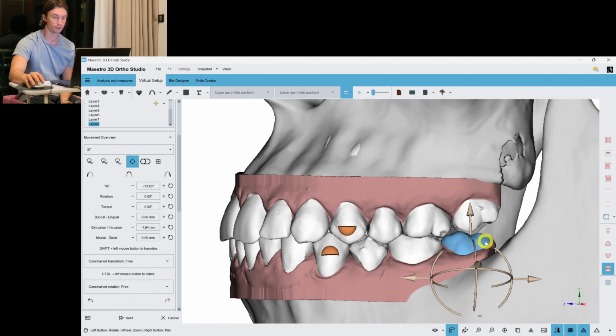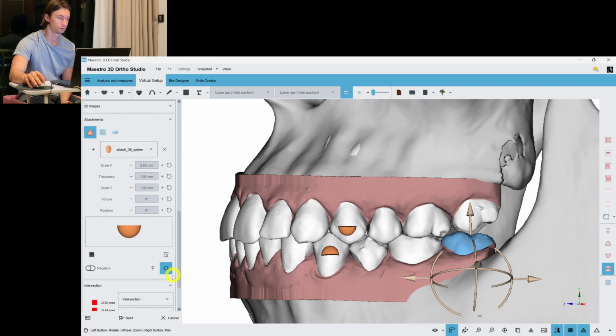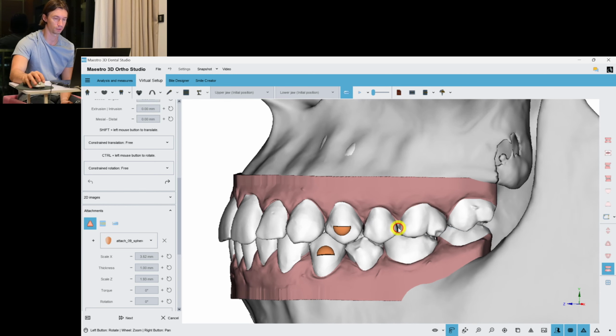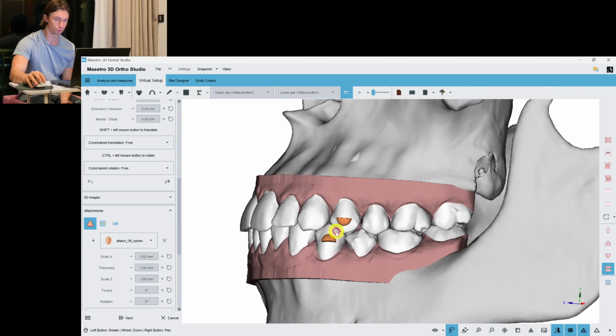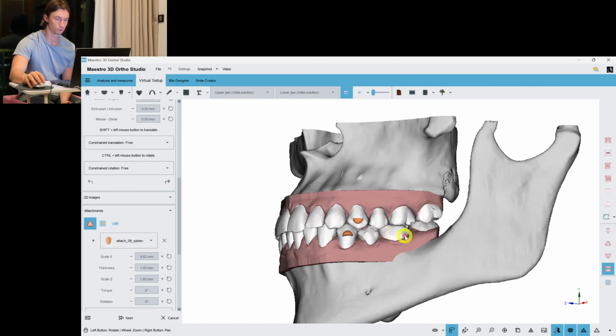So we think that the occlusion will help us and the intrusion will happen from biting with the antagonistic tooth. Or we can use some mini screws or some other techniques. But with just aligners, we are not able to intrude the molar. It's not possible. But it will be intruded by the natural forces when we finish the treatment. I also give my patients chewies so that they help us with the intrusion as well.